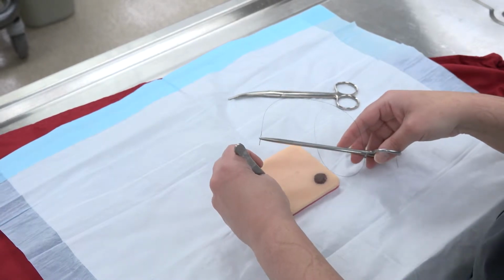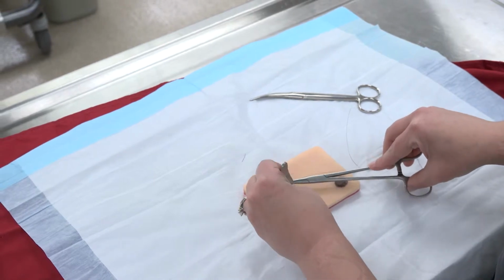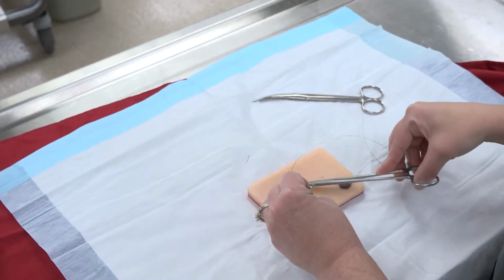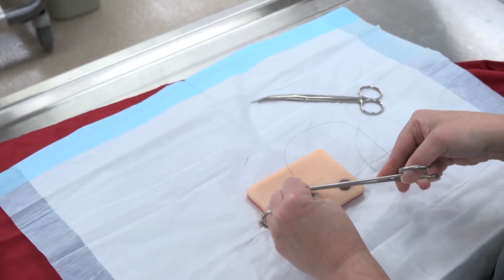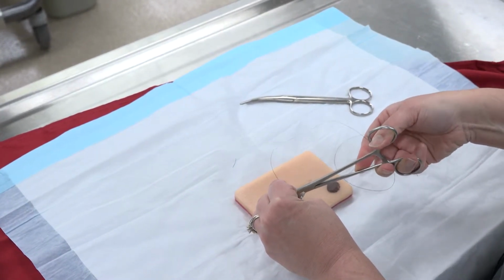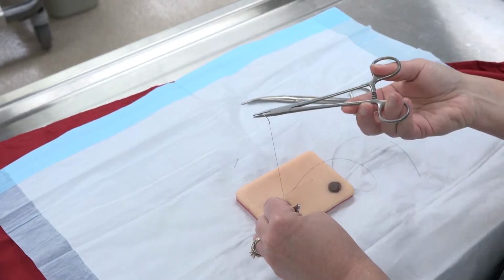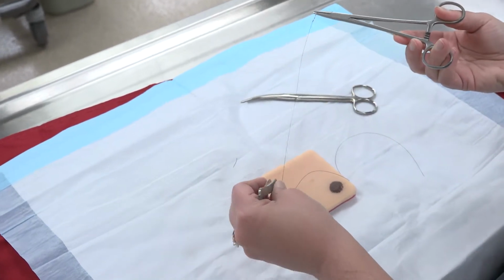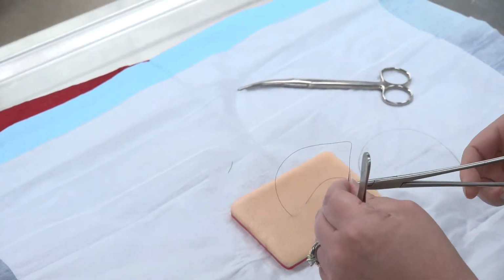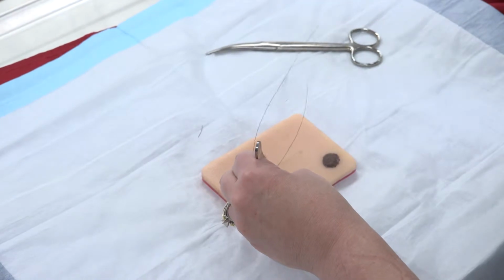Okay, so the first is the first knot, which has to be buried. So I'm going to go deep to superficial on my side because that's the easy way for my hand to rotate, and all of these needles are curved, and so we're going to rotate as opposed to push the needle through. All right, so that's deep to superficial, coming out right under the epidermis. So this should be in the dermis, but under the epidermis, because that's the holding layer of the skin.